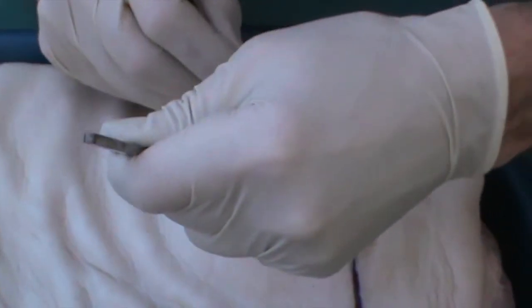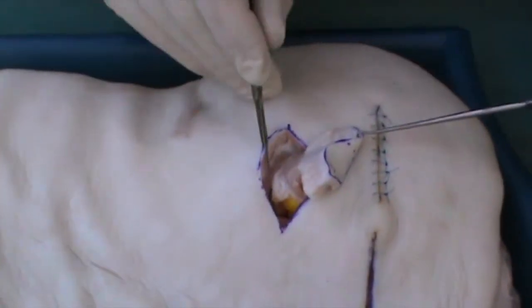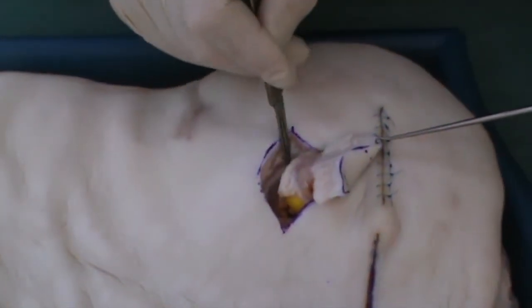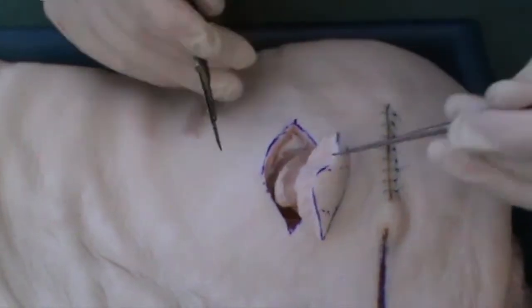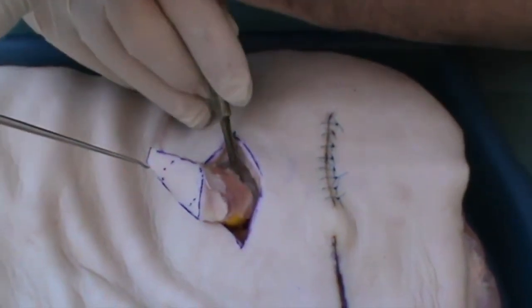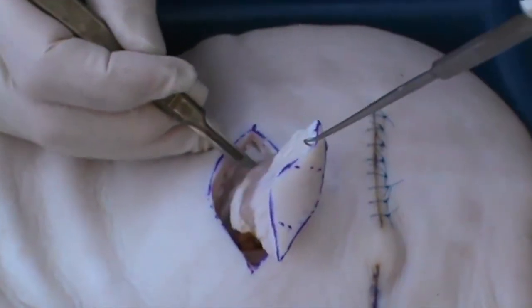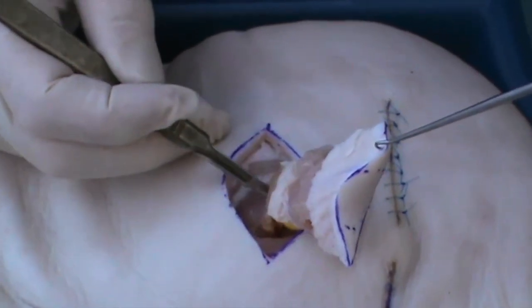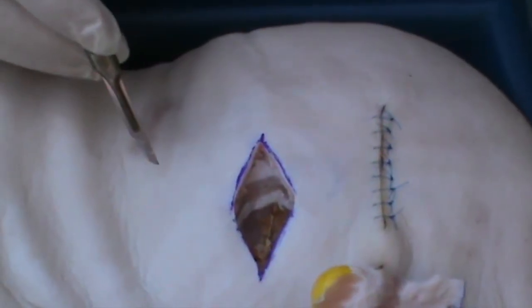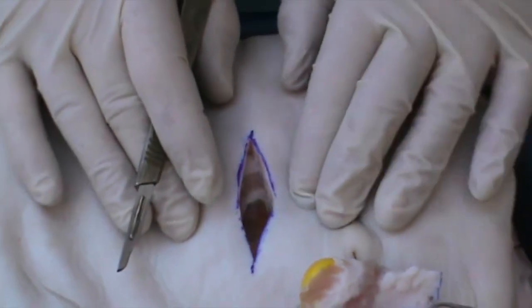This is a much more involved process than a simple cyst that has never been infected or inflamed. You can see we're lifting it out. In real life, this would be separating from the fatty tissue to enable you to very gently remove the cyst and leave quite a large cavity, which will be closed with deep sutures followed by skin sutures.